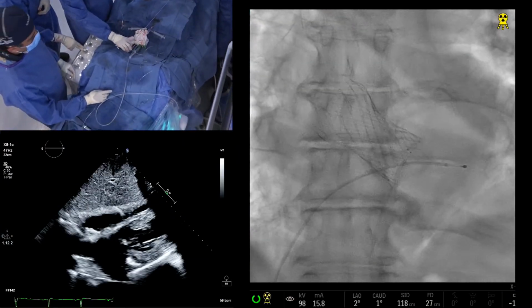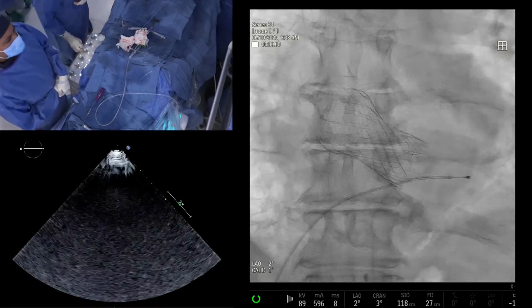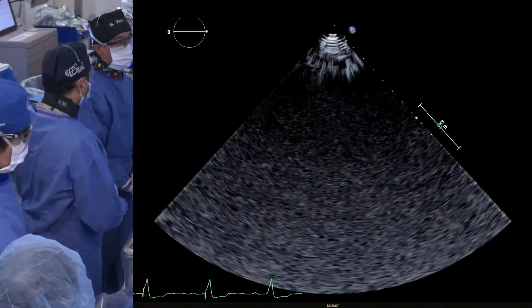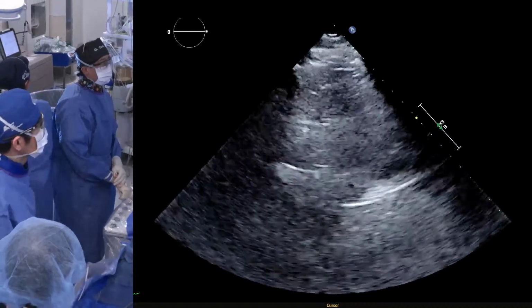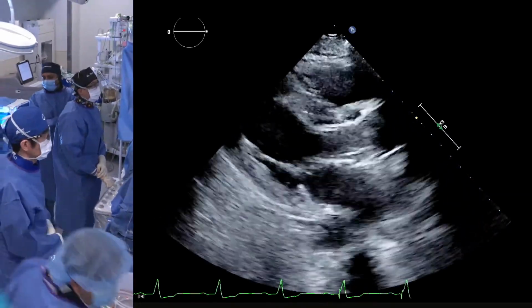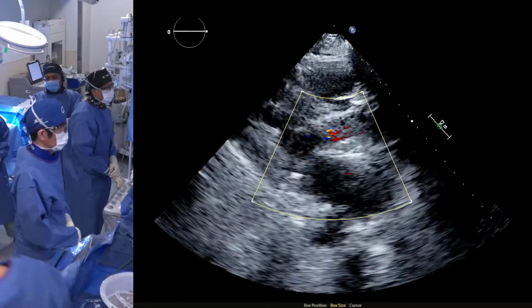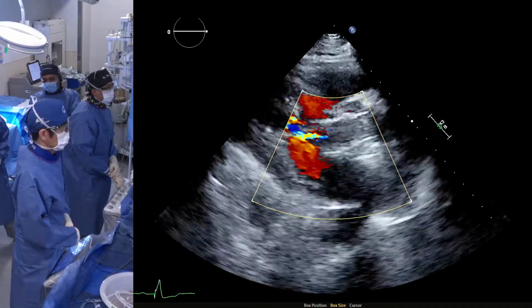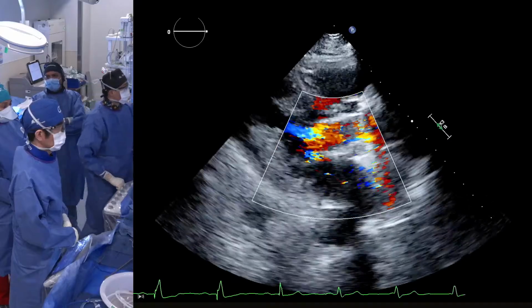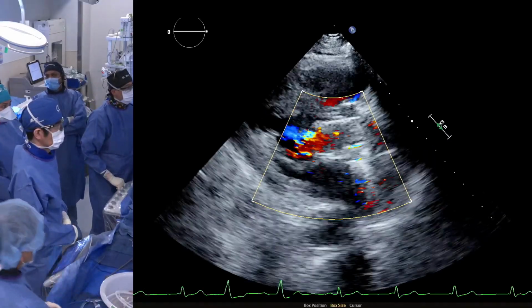So that's the key. Now maybe Parashram can say in which cases we are using cerebral embolic protection now. Sure, Dr. Sharma. We have definitely gone down on our use, let's say in the last 2 months since the trial data have come. In which cases do you think we should be using it now? We tend to use it for valve-in-valve, especially degenerated transcatheter valves or surgical valves, or bicuspid patients, especially low risk, or anyone with a heavy calcium score. Those are the patients that we restricted to use the cerebral embolic protection device for.